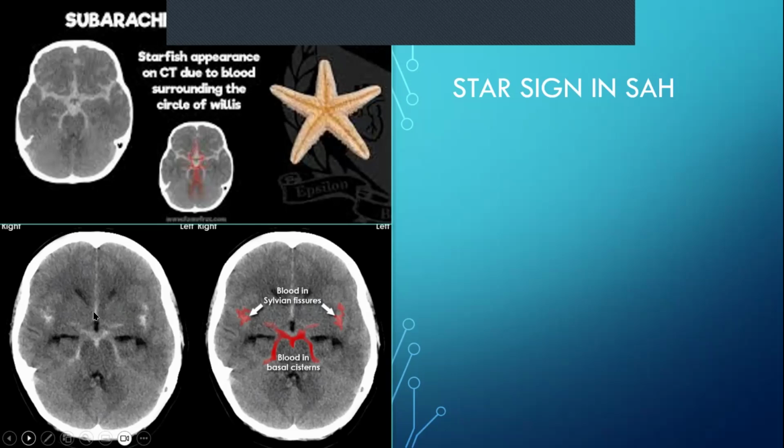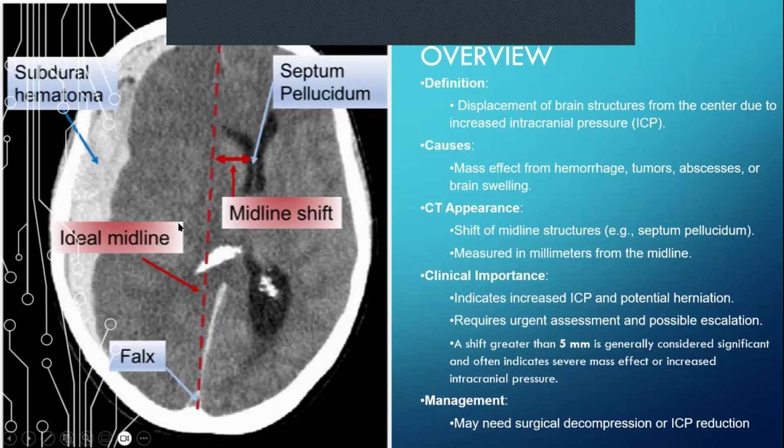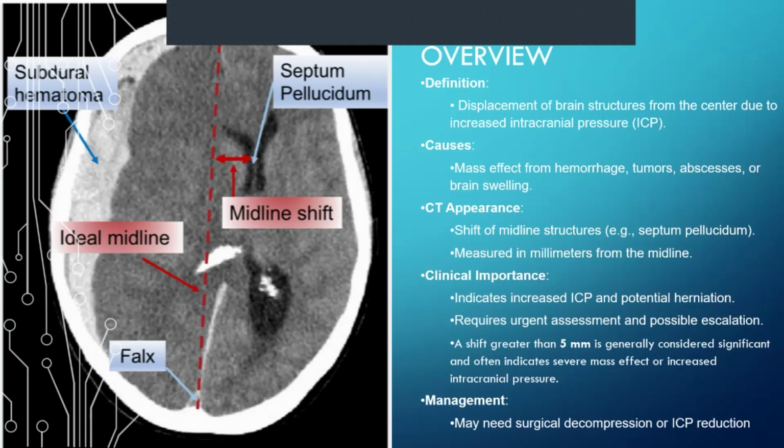So before any of you start feeling like, okay, you know what, I need to know the brain inside out before I can start commenting on CTs and things like that, as you can see in trauma, it's quite easy to just go ahead and make a quick assessment based on what you can see. Even amongst radiologists, you have neuroradiologists, people who specialize just in the brain and looking at imaging of the brain, simply because there's so many things that can be found. So there's no way you're an expert at the end of this little chat that we've had. But I hope that you'll at least understand the basics of what to look for in an acute trauma CT.